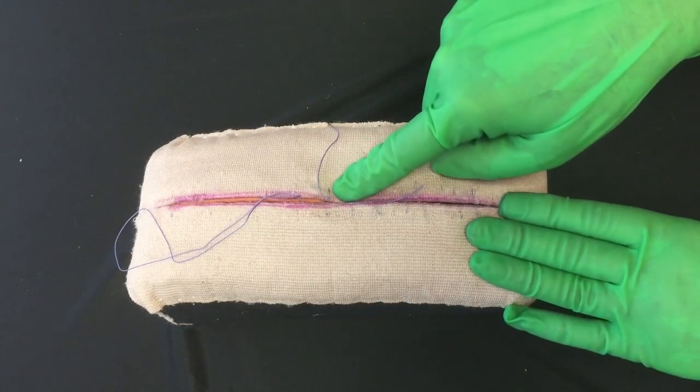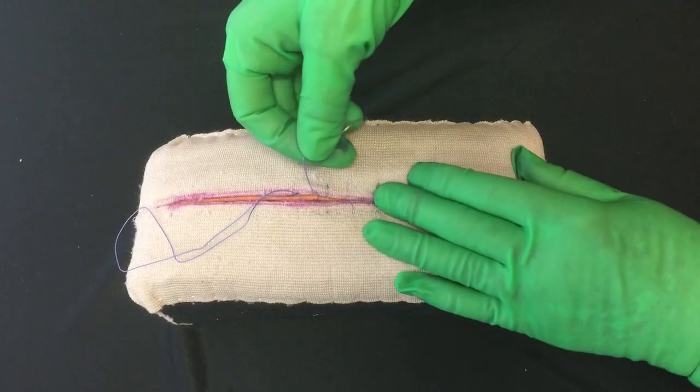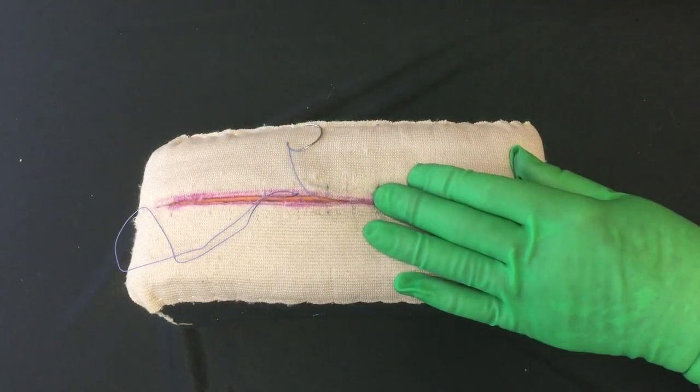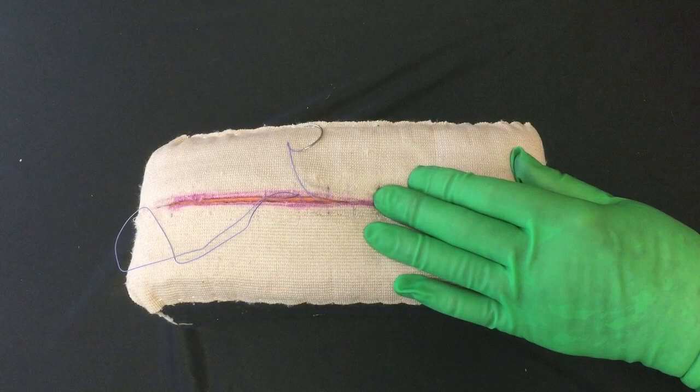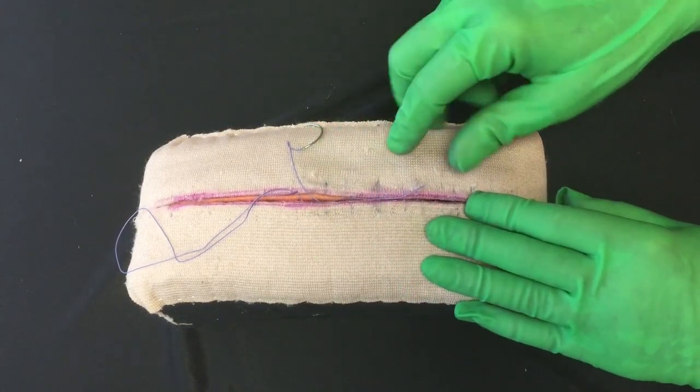So this here is a deep dermal stitch that I've taken. Don't just pull out the excess suture with your needle holder and yank it up in the air. I did that when I first started and the surgeon was next to me and actually hit him in the head with it. So you want this in the field where you can see it.